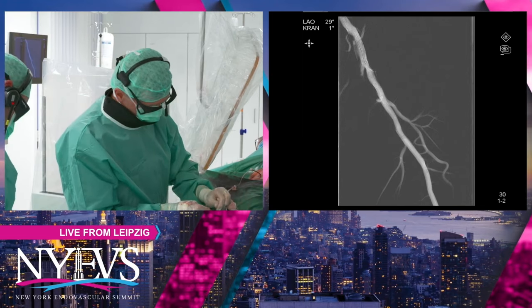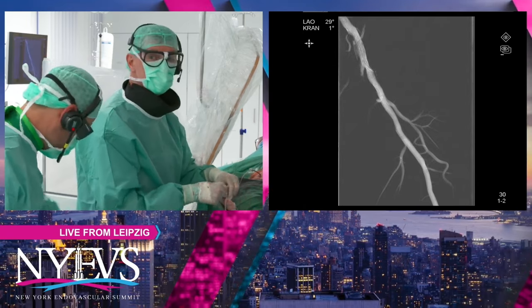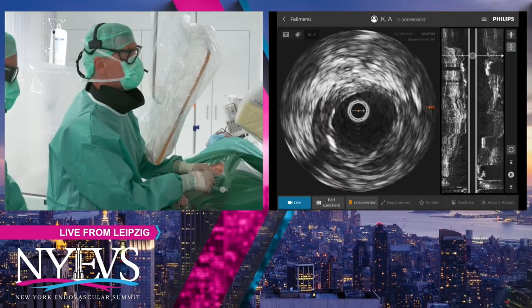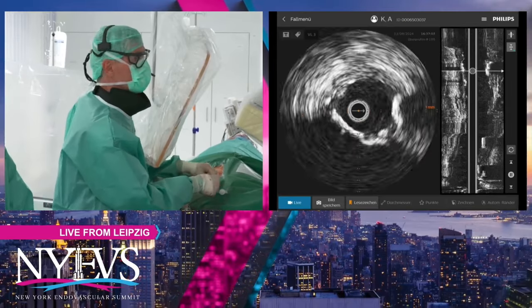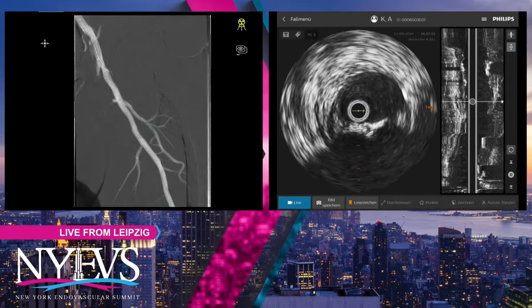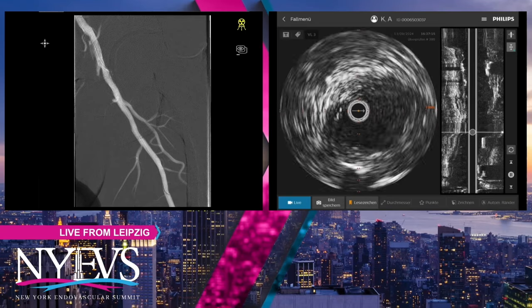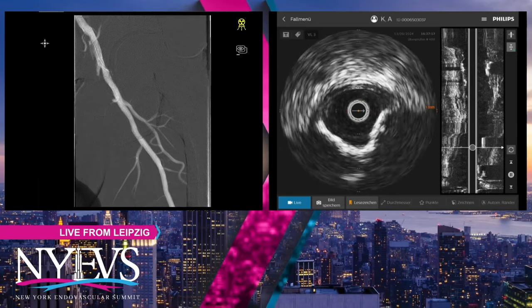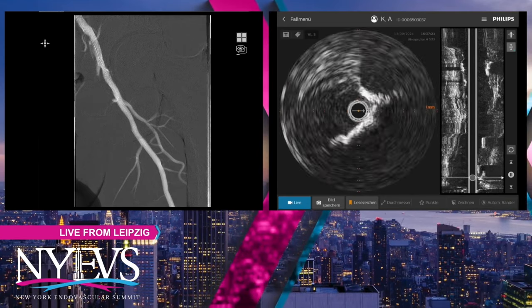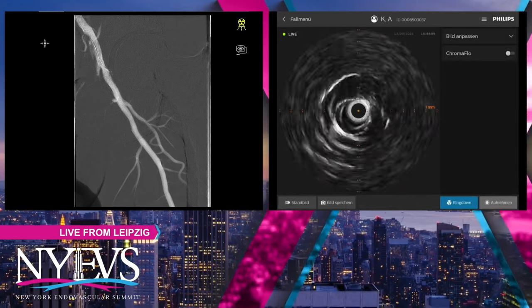Sorry. Can you switch to the IVUS then? Oh yeah, here it is. Maybe you can show both IVUS and the angio. We did already a run here after. Oh, that's already after that. But now my live gain, IVUS. Yeah, so now we have angio and IVUS.